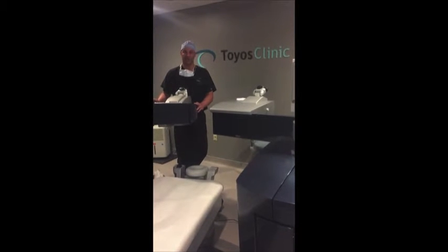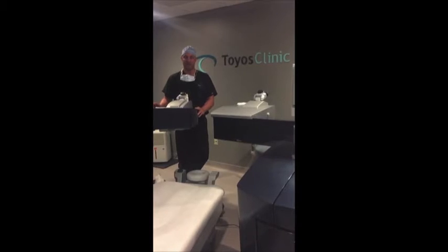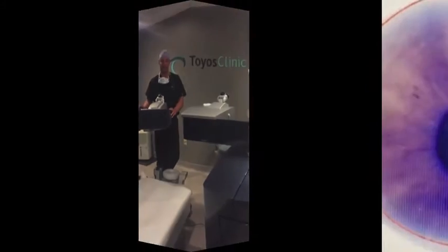Hi, I'm Dr. Toyos of Toyos Clinic, and we created this video to show you a new way of doing cataract surgery: custom cataract surgery using the WaveLight Laser.